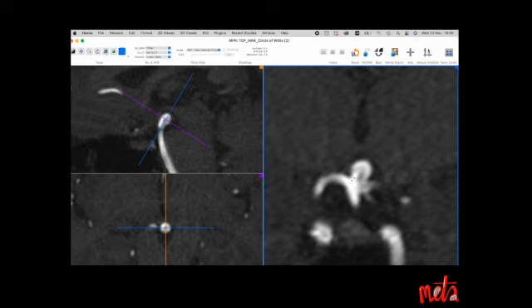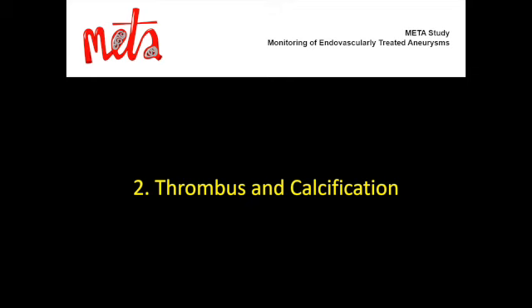The first again is the neck itself. Number 2 is the height perpendicular to the neck, extending all the way to the aneurysm dome, and the third again is the diameter perpendicular to the height. And that's how we will ask you to record your measurements of intracranial aneurysms. We'll also be asking you to record whether an aneurysm is thrombosed or calcified, and I will go through that now.